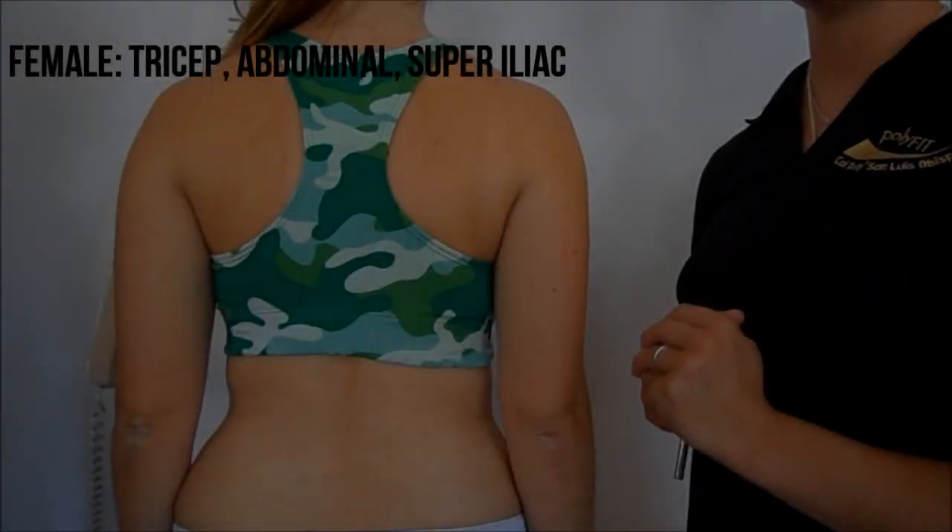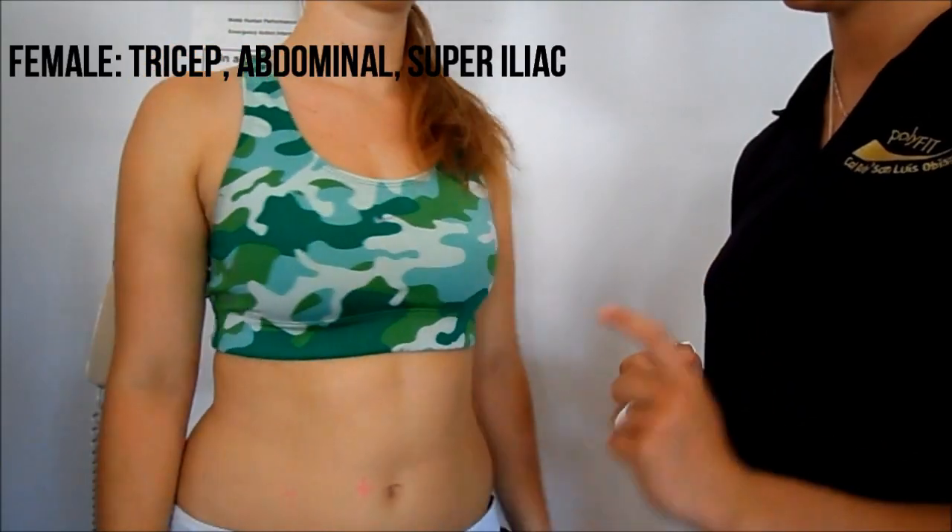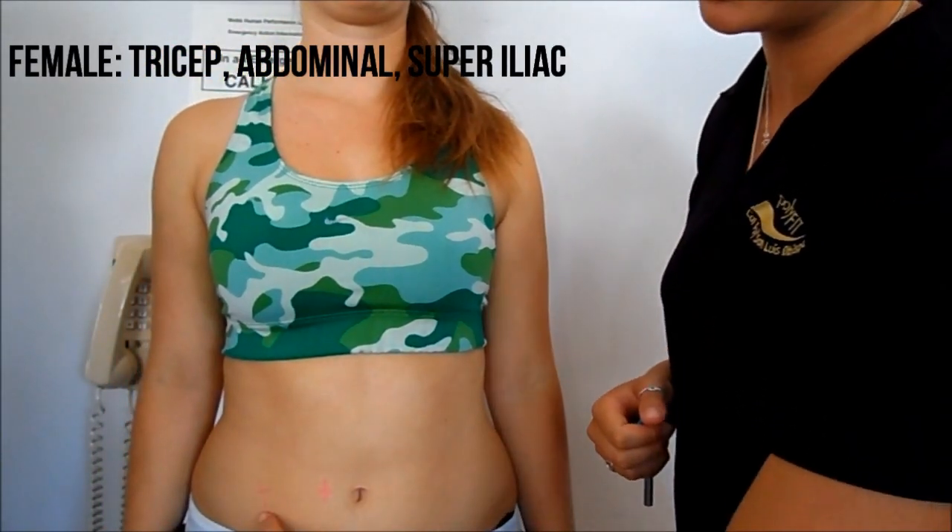Make sure you don't do all three measurements at one site at one time. Again, the three testing sites on women are the tricep, the abdominal, and the suprailiac.